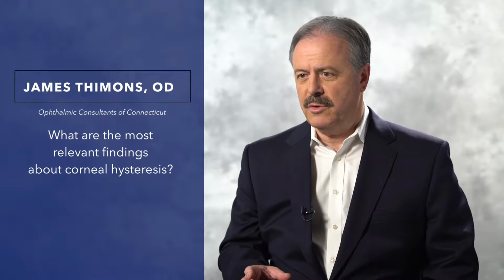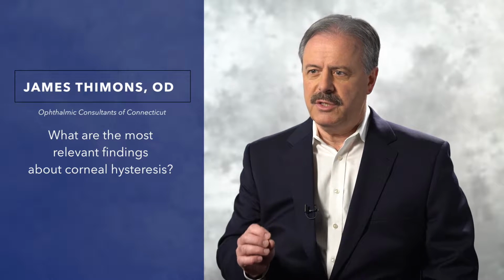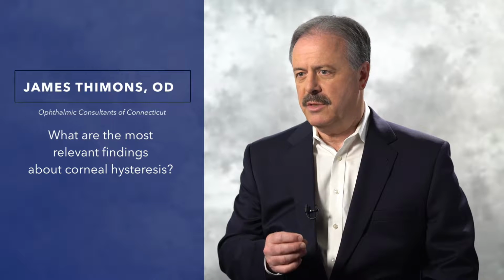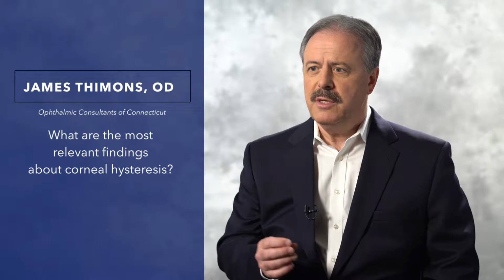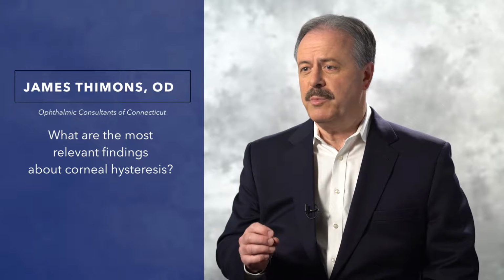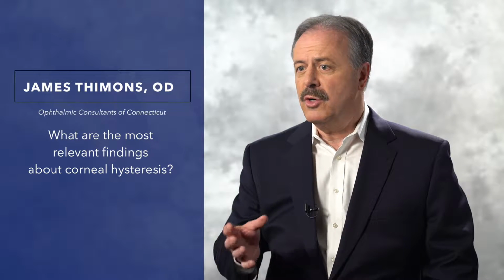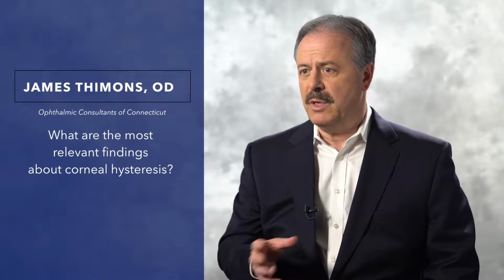Well, corneal hysteresis has been shown in hundreds of articles to represent the biomarker that is indicative of both rate of progression and relative risk of disease state. So in patients with glaucoma, the use of the biomarker, the corneal hysteresis element, helps us understand which patients are most likely to progress the fastest and may require greater levels of care and more aggressive management relative to the intraocular pressure.